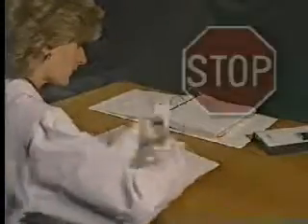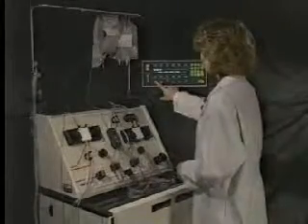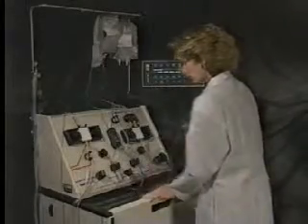Stop the tape now and do exercise 4 in your workbook. Now, we are ready to load the centrifuge channel. Press the unlock cover key, slide the cover back, and lower the door.